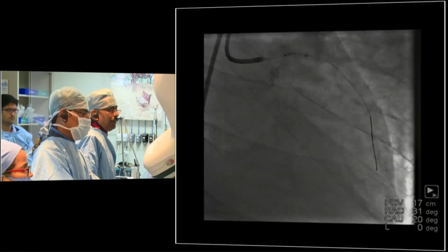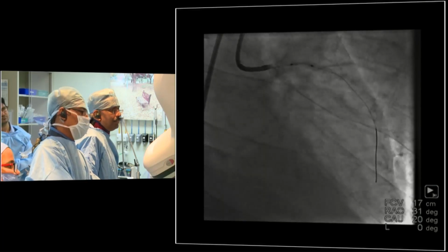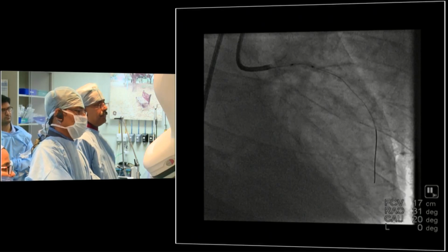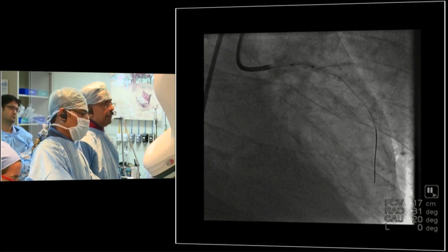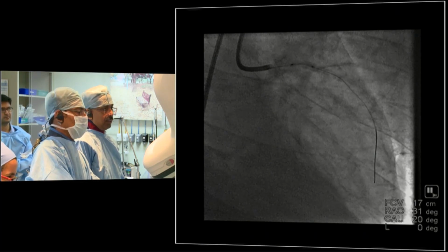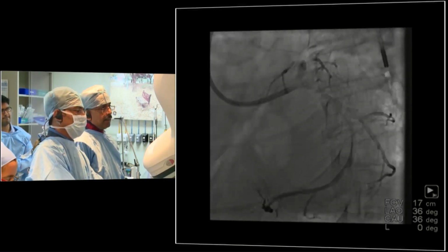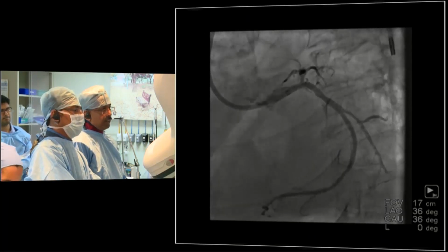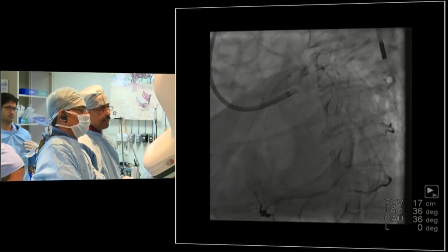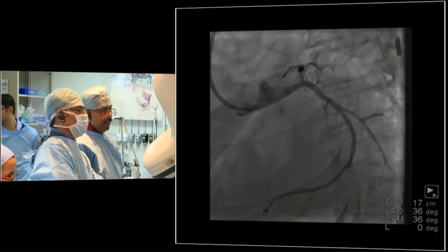Now, wouldn't it be better to stent the OM first and probably go on with the crossover technique? Maybe you will end up with the crossover technique as things go by. Well, there are many issues, Madhavan, in this case. One is that the OM is a very long lesion. You can play that back, please. You can see all the flows are good. I'm in no urgent area. There is a big circumflex in the proximal area, a big circumflex after the branch, and a big LPDA.